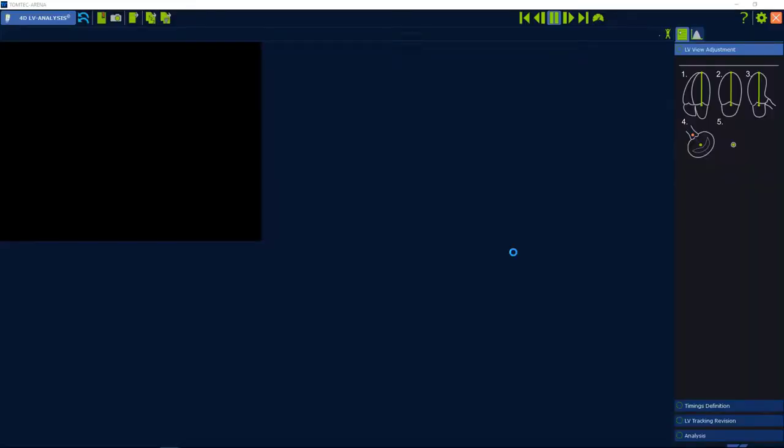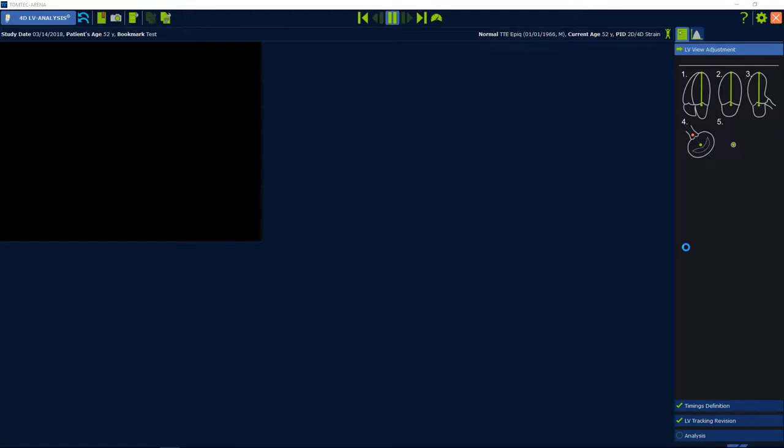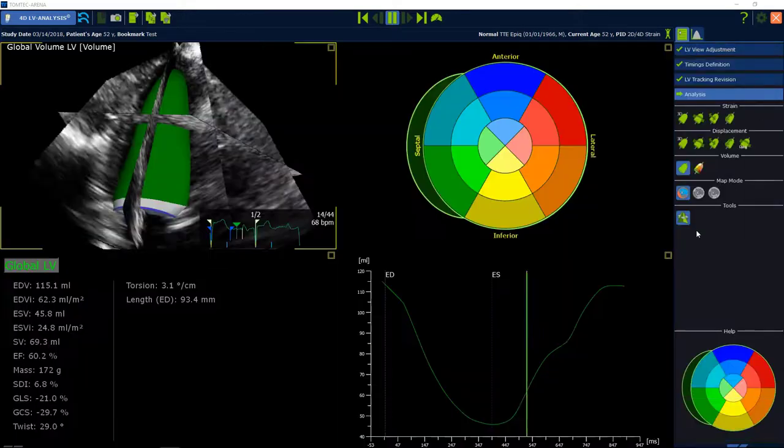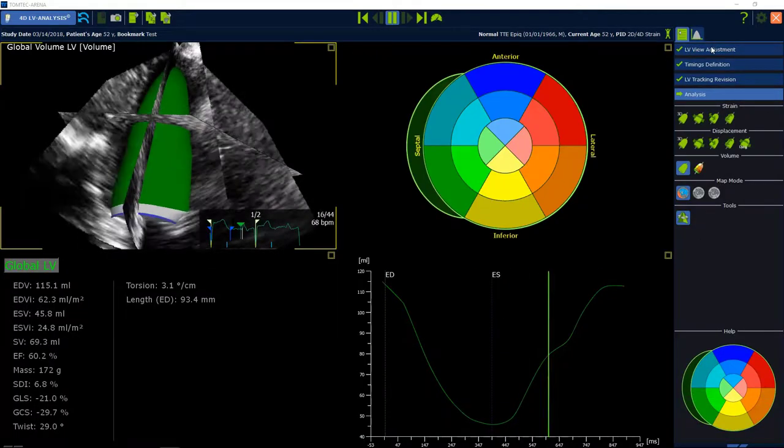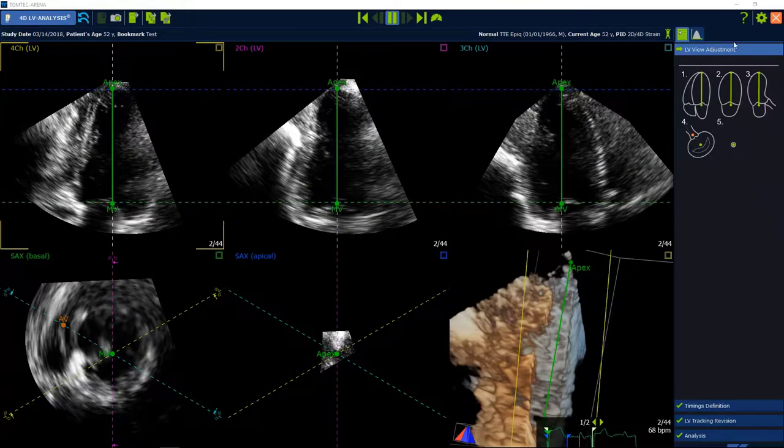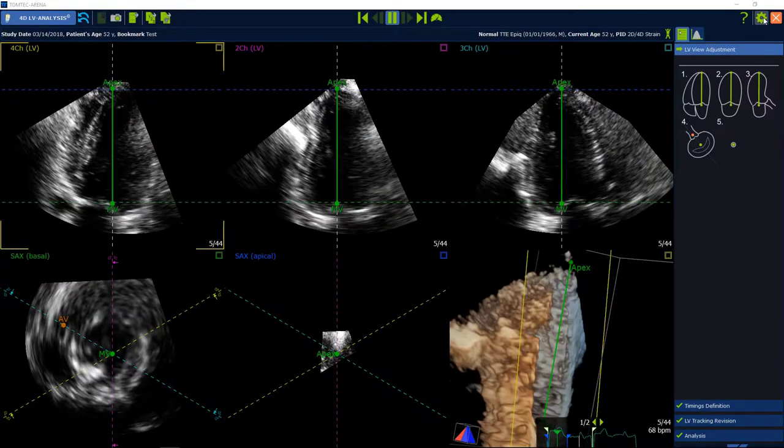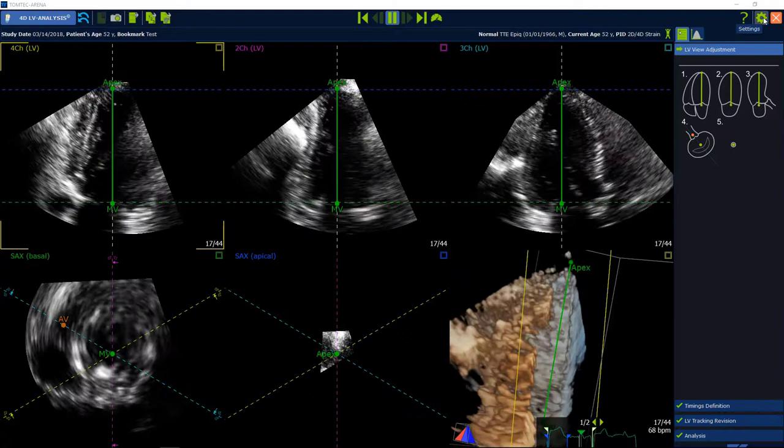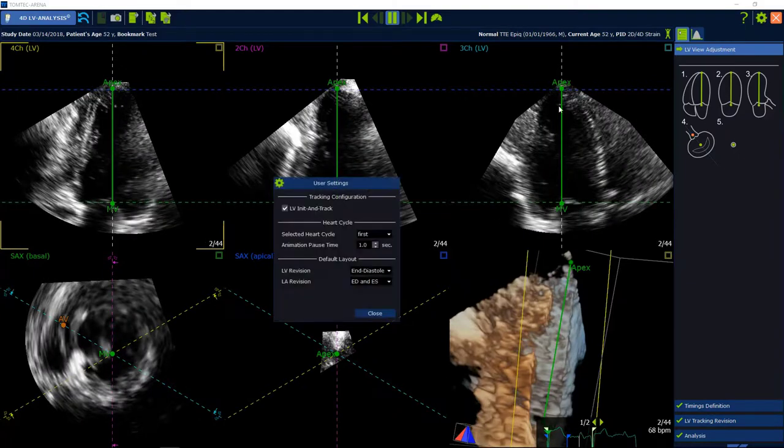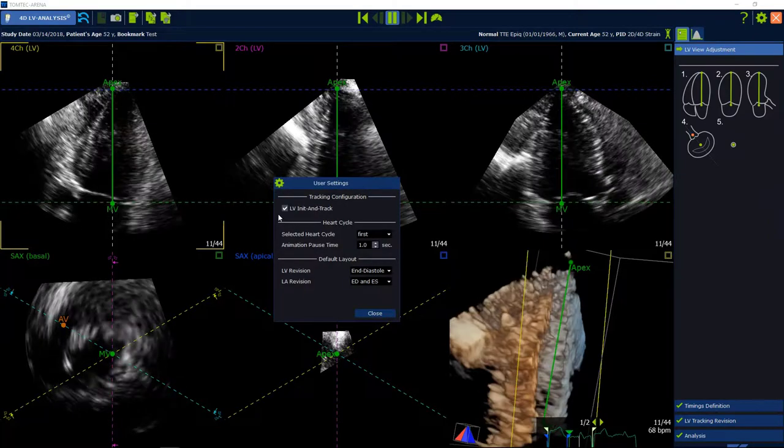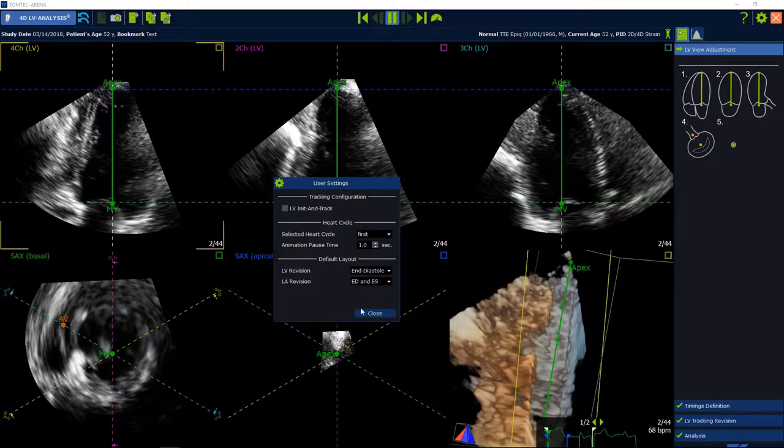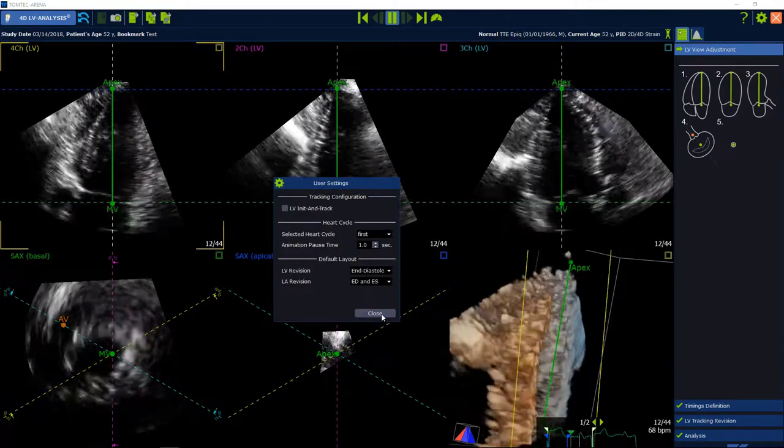To deactivate tracking per default please go back in the workflow in the first step. See on the right upper hand corner the icon for settings. Remove the check mark LV initial and track.